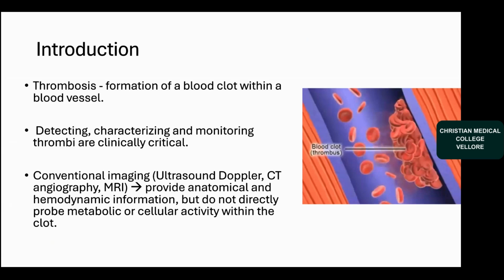So detecting, characterizing, and monitoring thrombi are clinically critical because they can lead to various diseases like stroke, MI, and more. And it can also be a leading cause of mortality.